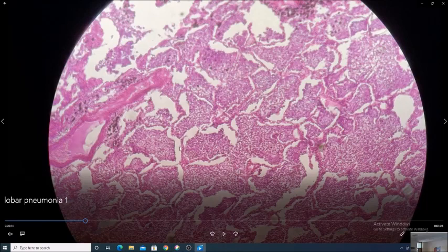So this is the single alveolus we are considering. This is the exudate. Can you make out a space between the exudate and the alveolar wall? Okay. This is typically seen in the stage of Grey Hepatization, where the fibrin starts contracting.